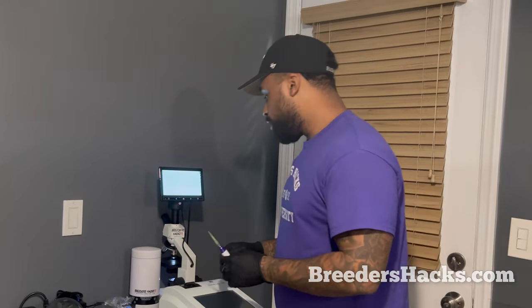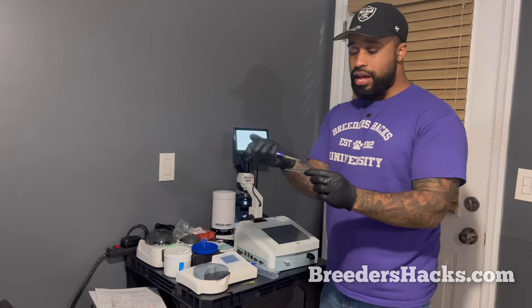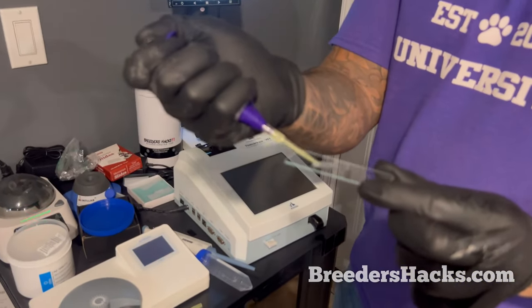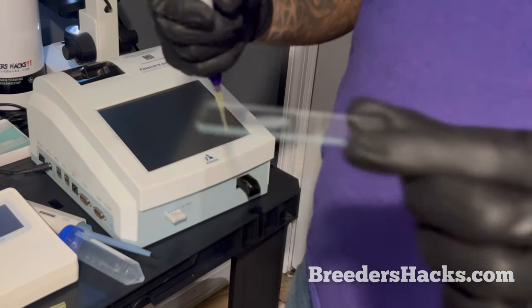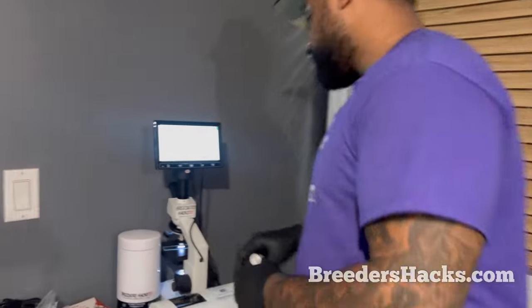So now what we'll do is we're gonna go ahead and take a microscope slide, and we're gonna take the semen now, and I'm just gonna do a few droplets. You only need a couple droplets right there on the microscope slide, and that's it. So I'm gonna go ahead now and put this under the microscope to take a look and see.